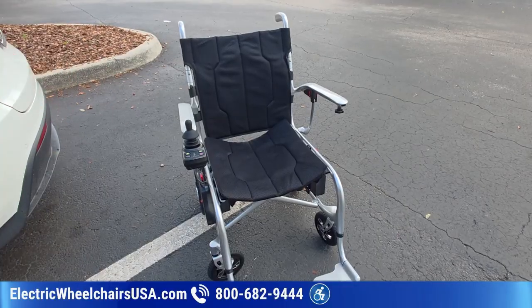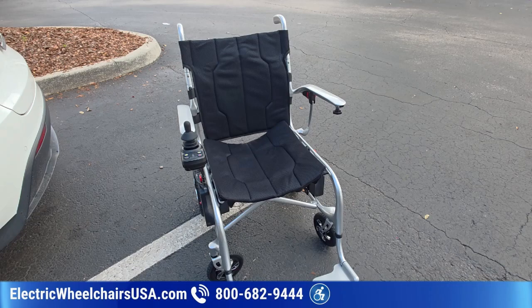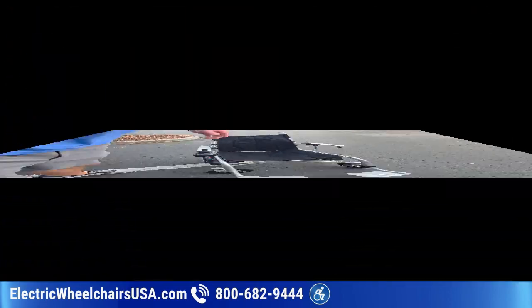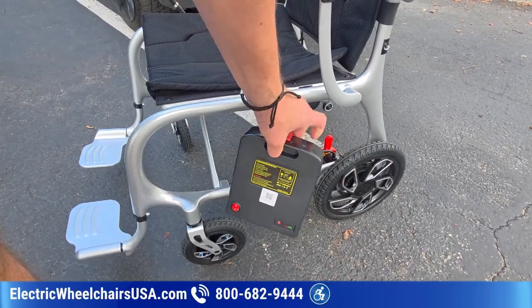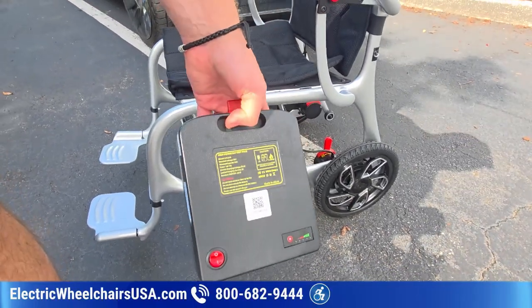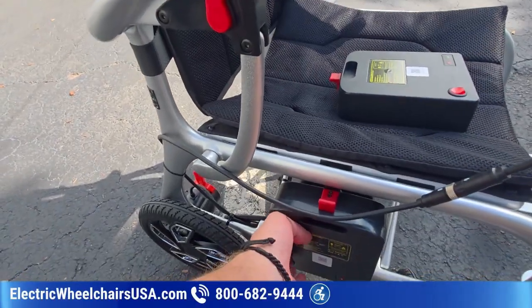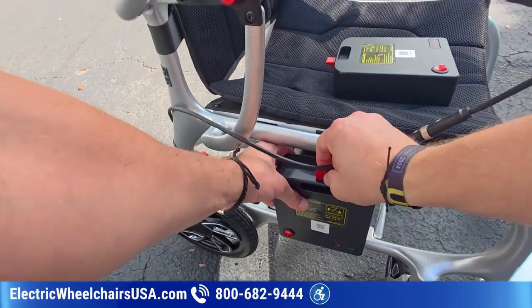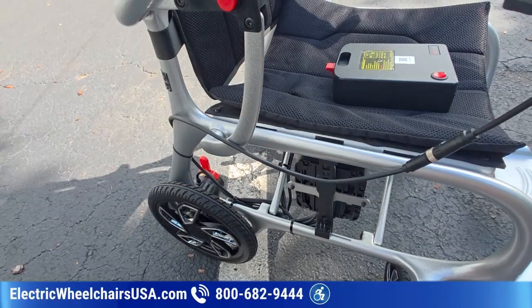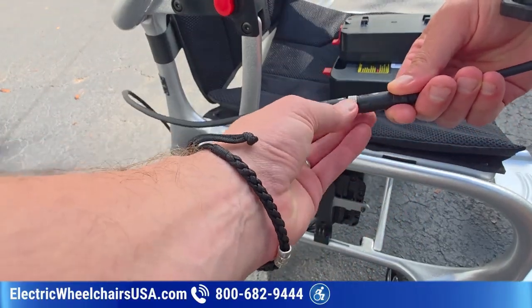Now, I'll show you a couple things about, when you want to get it down to that lightest possible weight, this is what you would have to do. I'm going to take the batteries off. So push this red tab, comes off easily. These weigh about 3 pounds each. There's another one on this side. So remove those. Joystick, easy to remove.